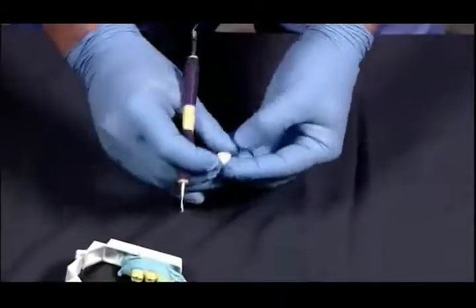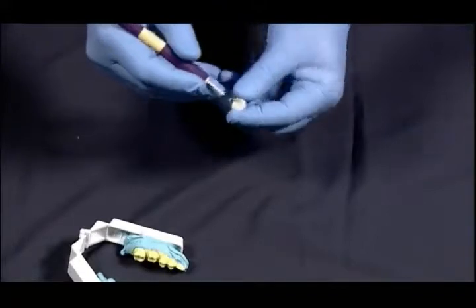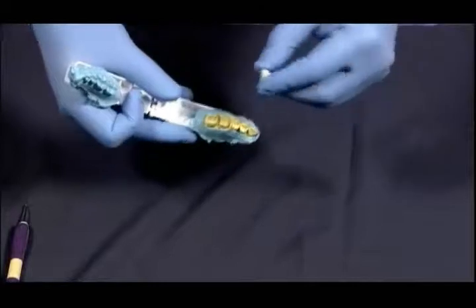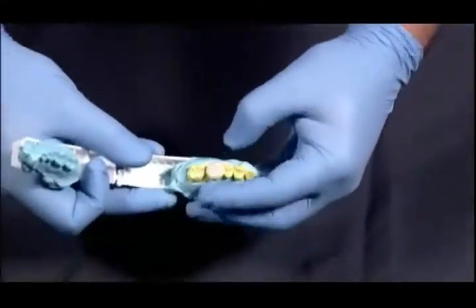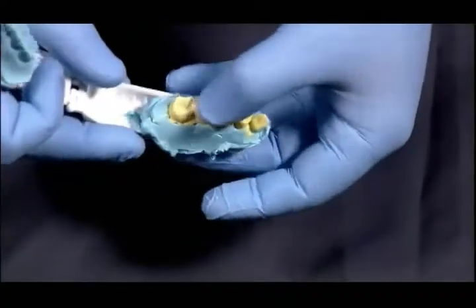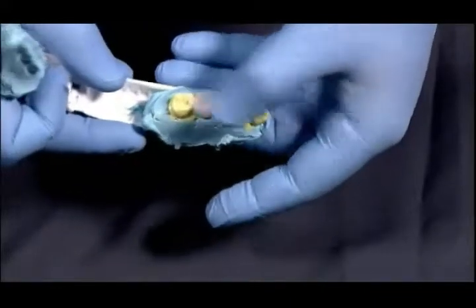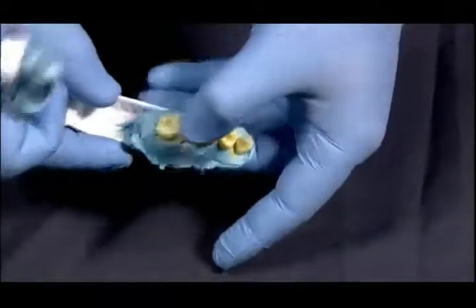So what I want to do is make sure when I'm loading the tray that I'm getting material into that interproximal area so that we fill the entire embrasure. Now what you're going to do is orient the crown onto the tooth. Let me move that forward for you. You're going to see I'm going to slowly start to push it down onto there. Excesses are going to flow out around the peripheries of the crown. And I had overfilled that significantly.